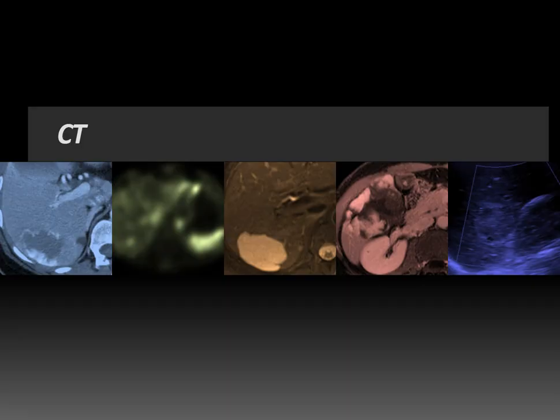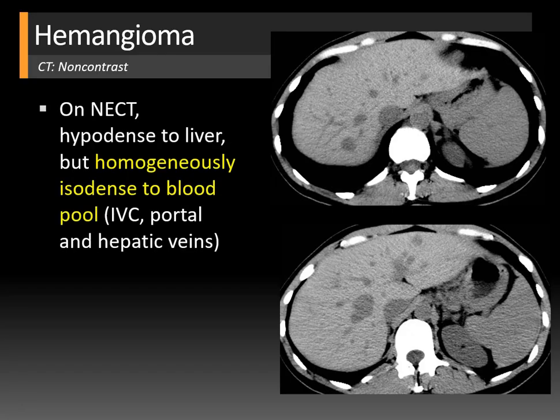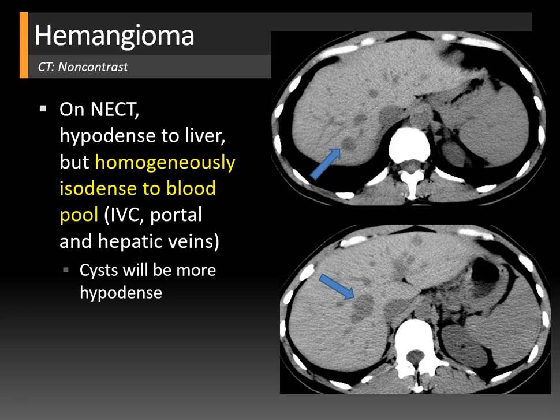On CT non-contrast images, hemangiomas tend to be hypodense to the liver parenchyma but homogeneously isodense to the blood pool — the same density as the IVC, portal, and hepatic veins. You can see hemangiomas blending with adjacent hepatic vasculature. Cysts tend to be more hypodense than the blood pool, while metastases and malignant lesions are often more heterogeneous.